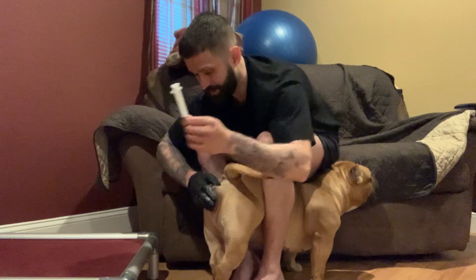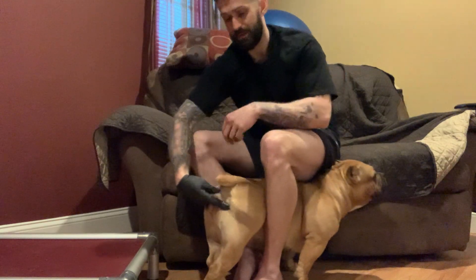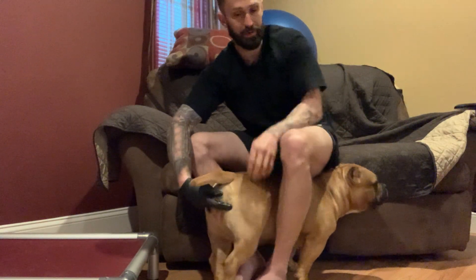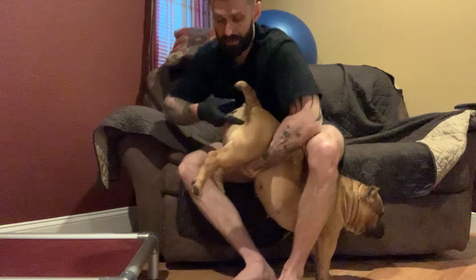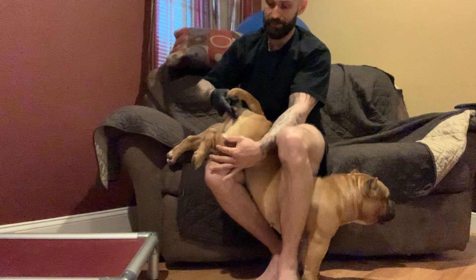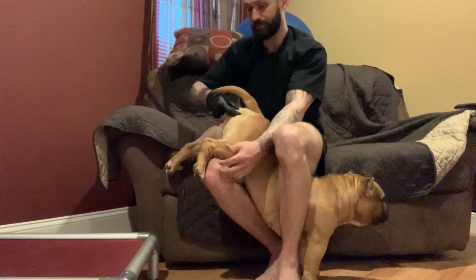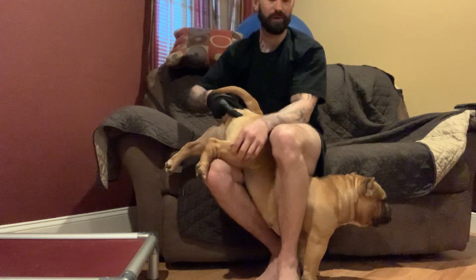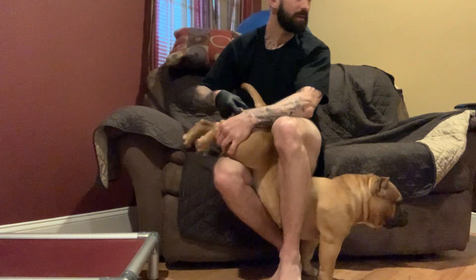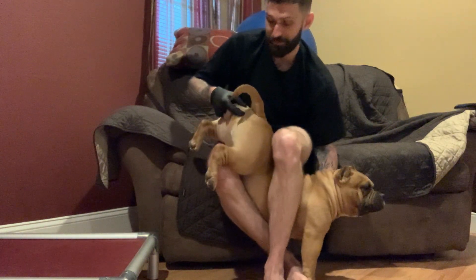Pull it out pretty quick, stick your finger in — that's the fun part. Massage right there. If you lift your female up like this and massage right over her vagina, between her butthole and her vagina. My son's glad I think it's funny.